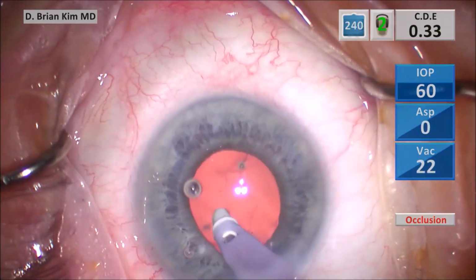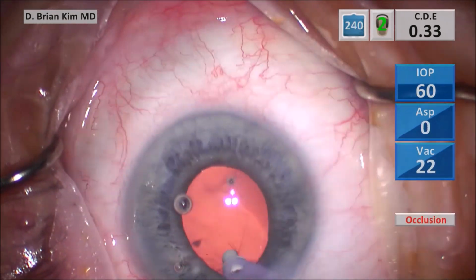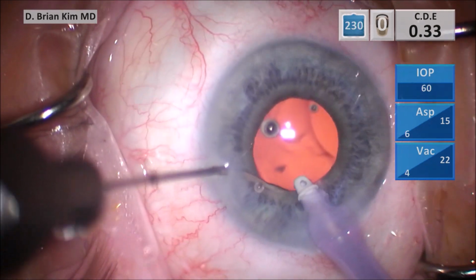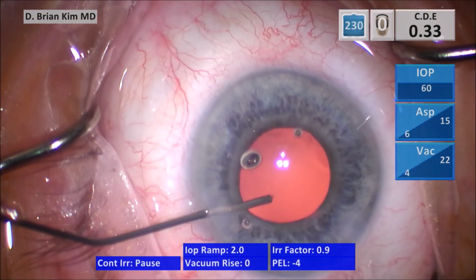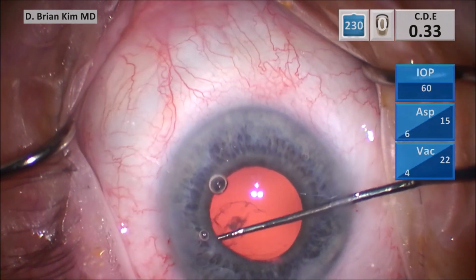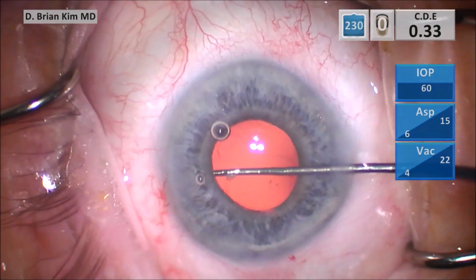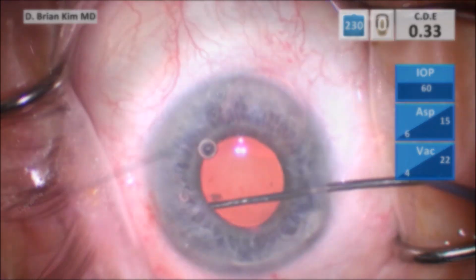And then I'm going to use a BSS cannula, and I'm flushing the subincisional capsular fornix to see if there's any cortical remnants. In the process of doing this, I think I see a little bit of something there, but again, I'm not really confident there's anything in this area. I'm going to switch to the viscoelastic and push some cohesive viscoelastic in the bag, and I do notice now that there is some more cortical material subincisionally, and so I'm using the sweeper to help me tease out the cortical remnants from the subincisional capsular fornix, and you can see this is coming out quite nicely.